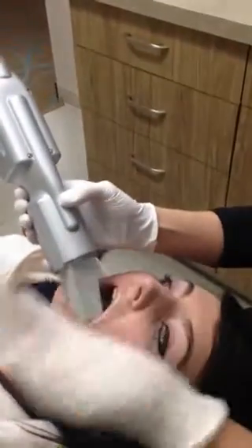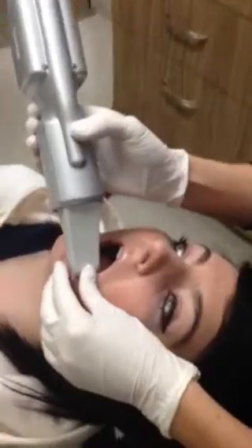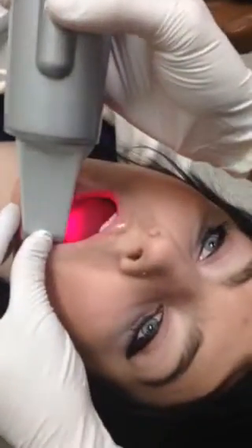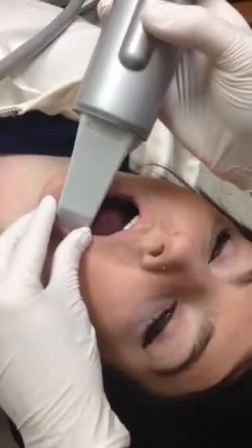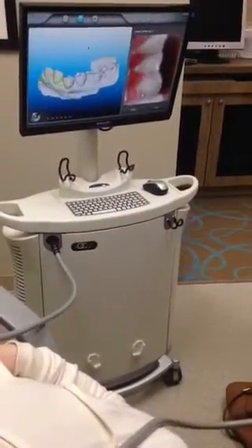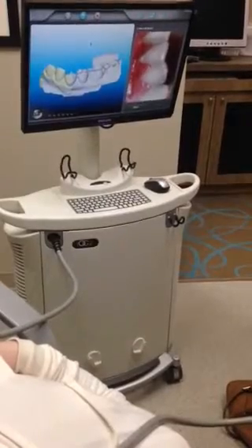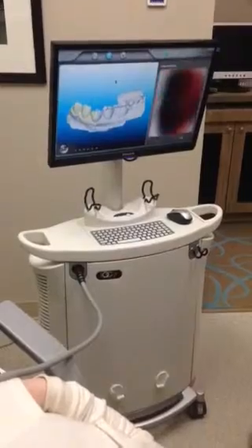And it works kind of in quadrants, buccal, and then lingual, then buccal, then lingual. So let's keep going all the way until we get to the front. And does it blow air as well? Yeah. I heard some to keep it dry. Yeah, just kind of keep the bubbles out of the way, and keep all the tissue dry so we can see it better. So what it's doing is taking a whole bunch of tiny little pictures and then stitching them together just to make that one big 3D image up there.